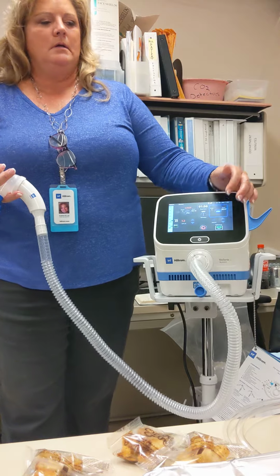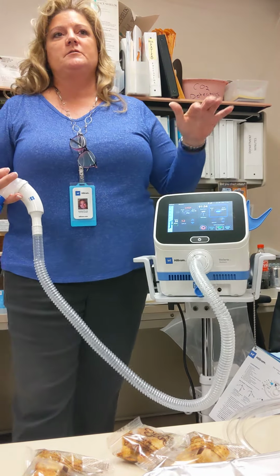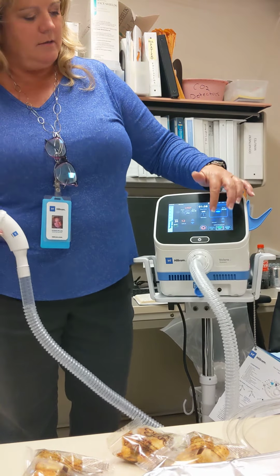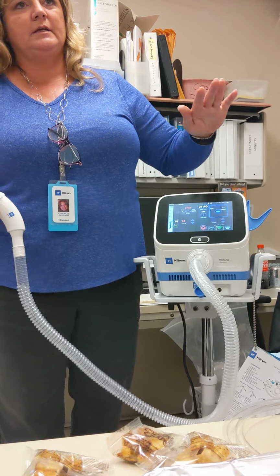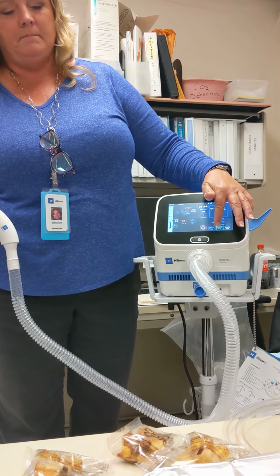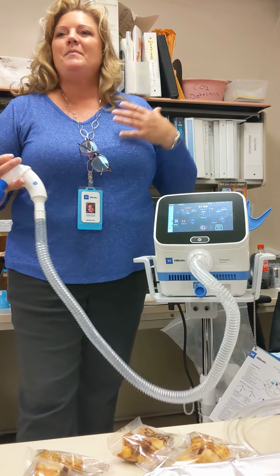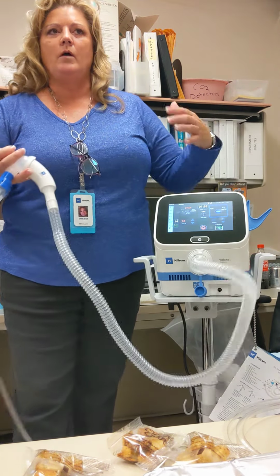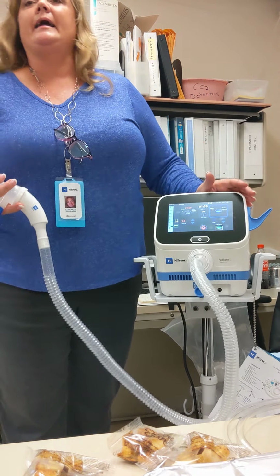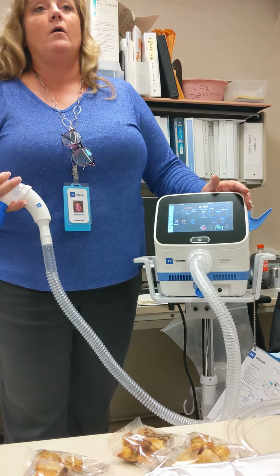Now, we have 3 oscillation speeds: 170, 230, 300. We traditionally start a patient on, I'm sorry, 230, medium. If they can't, this is slow. A lot of people don't like that because it's a bigger recoil. You're going to see most people sit between medium or high. But I would start in medium so you have somewhere to go.